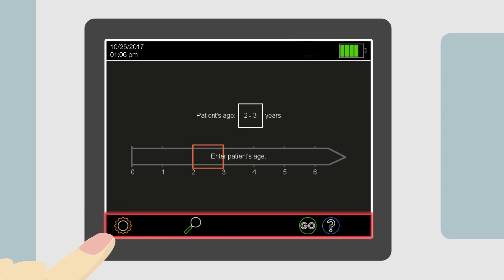Touching the settings button will display the settings page, while touching the magnifier leads to a page to enter patient data. The internal patient database is only available in the PlusOptics S12C model.